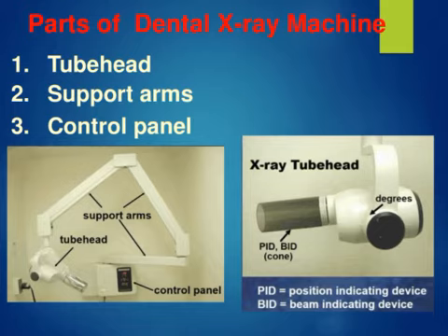Okay, so what is it? Is it A, radiation, or is it B, fluorescence? So, what is the property of X-ray which you can use?